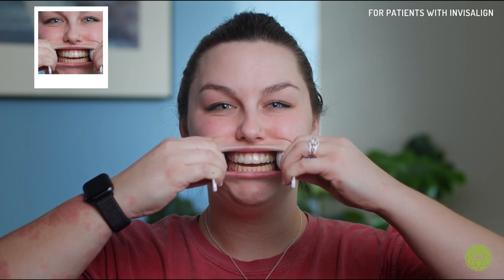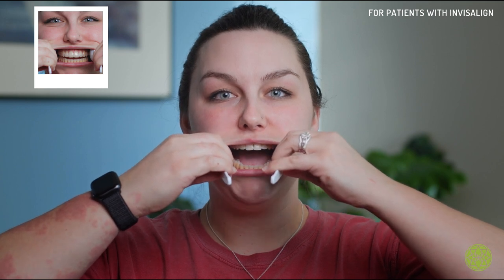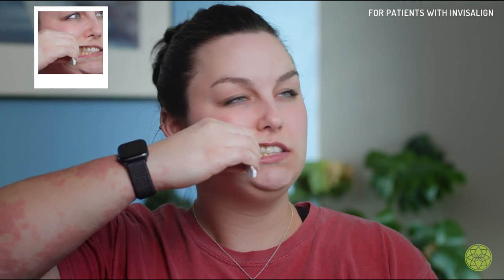For the next set of photos you're going to want to take your aligner or clear retainer out. Again using your spoons — these are very similar to the biting-down photos for our braces patients. Biting down all the way with the spoons on either side of your cheek, making sure you're getting super up close with the flash on. Remove one spoon, pull it to the side and make sure we're getting a biting-down photo of all those teeth. Switch sides, biting down all the way, making sure we're capturing all your teeth with the flash on.